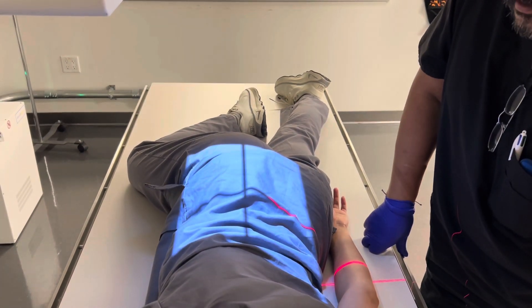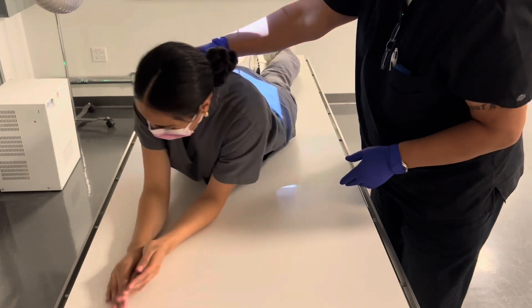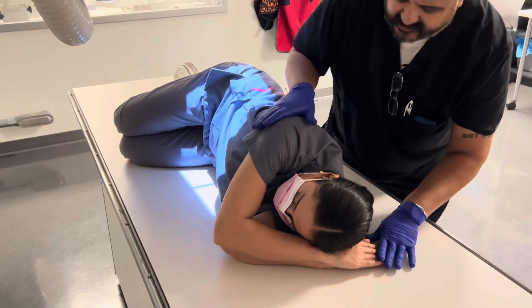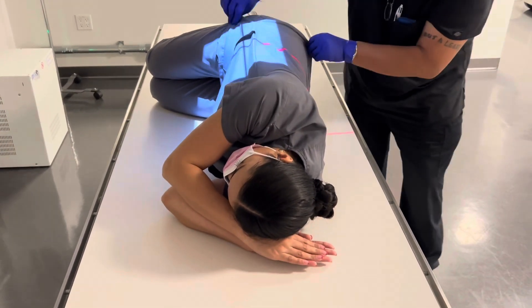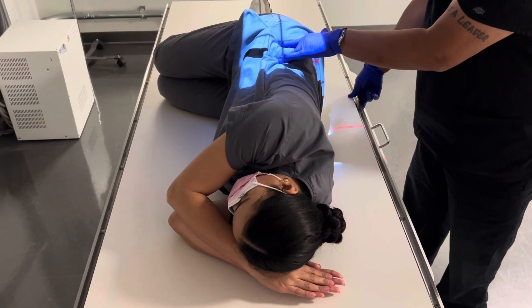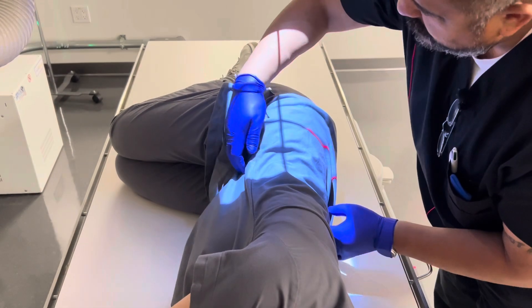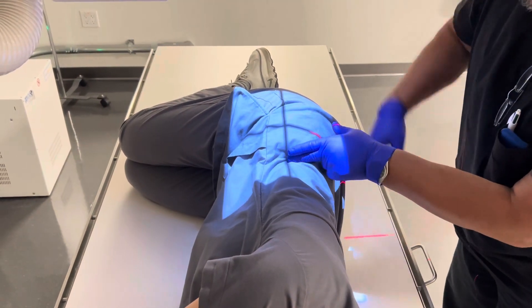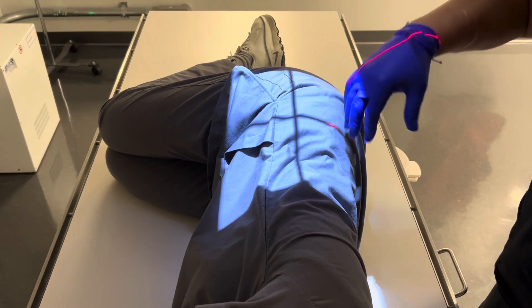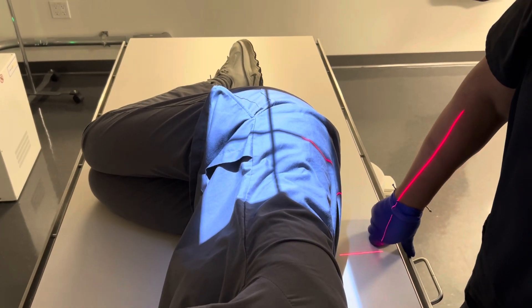Now for the left lateral: place the arm to the side, hands together, turn on the left side facing the wall, knees together and bent. Make sure the shoulders, hips, and knees are all perpendicular. Center down at the ASIS. I typically use the corner of the iliac crest to find this area. In the left lateral you're going to see the rectosigmoid region filled with contrast. Those are your projections for the lower GI — they're relatively easy once you've done enough of them, but understand what's happening to the contrast inside the intestines.